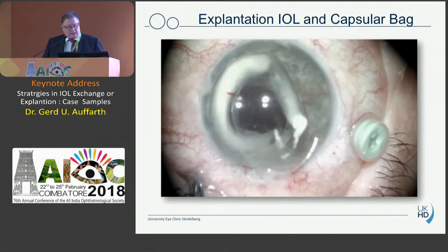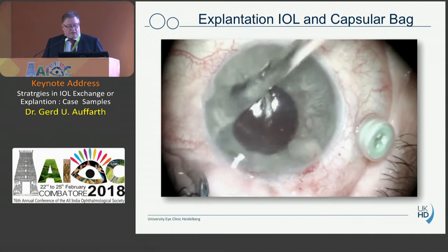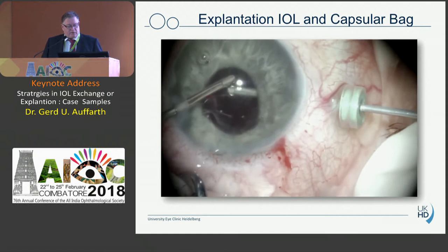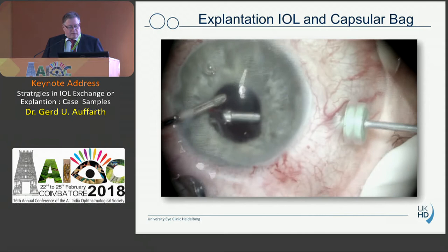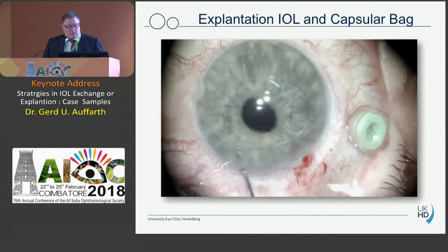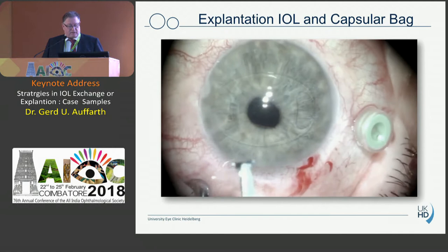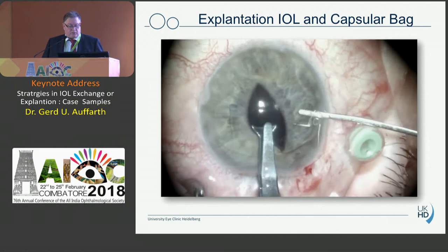With the Dödel forceps you can take out everything. Because I will put a retropupillary iris-fixated lens in the eye, I do a thorough vitrectomy. You don't need a second trocar — just go through the paracentesis over the irrigation and do the vitrectomy from behind, from pars plana. Then we put the Artisan lens first in the anterior chamber, aligned from 3 to 9. We fixate it behind the iris — not onto the iris, behind the iris — which has become routine. It's much faster than transscleral fixation.